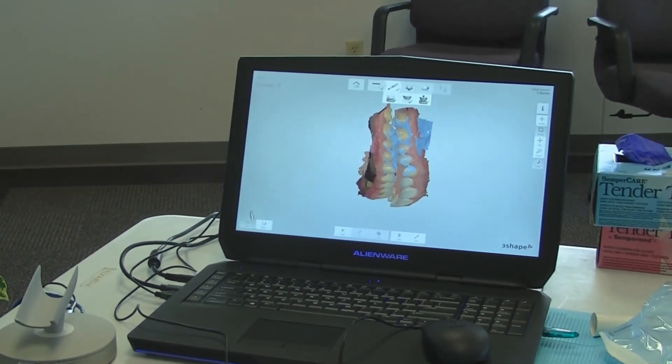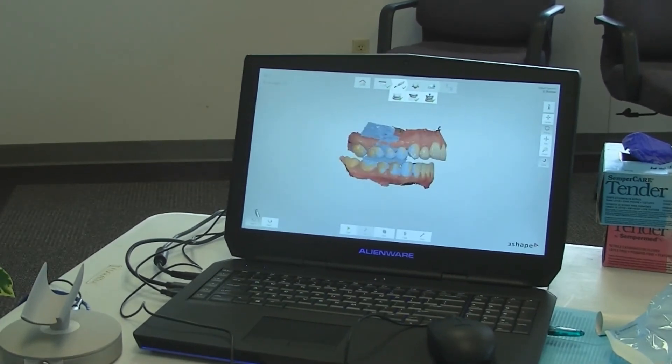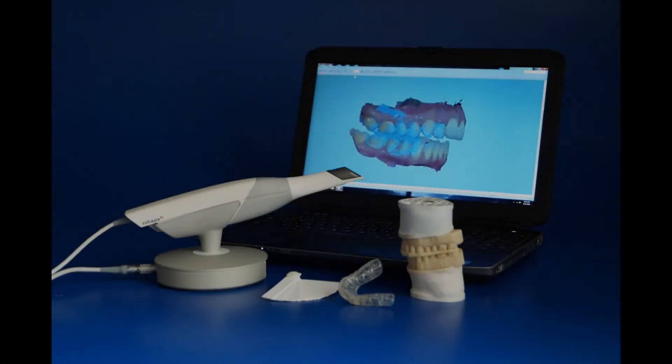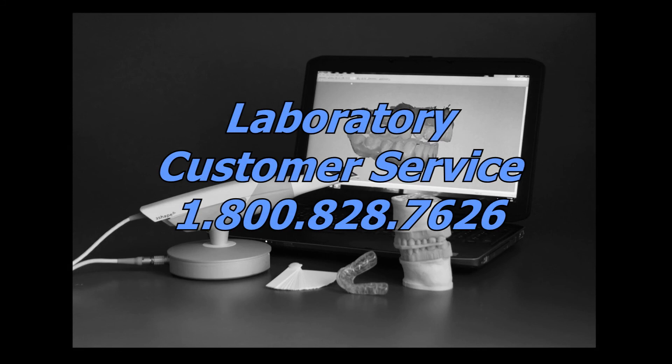At this point, your scans are now ready to be sent to Great Lakes for appliance fabrication. The lab will then print the bite in your scan position for model mounting and appliance fabrication. If you have any questions regarding this technique or how to send your scans to Great Lakes for appliance fabrication, contact Laboratory Customer Service for more information.